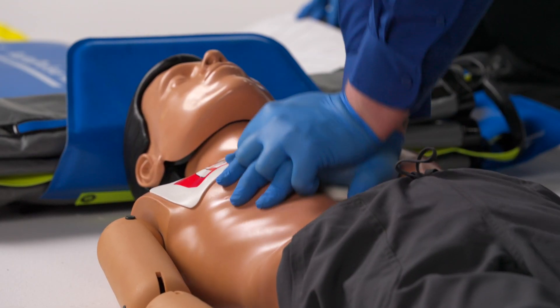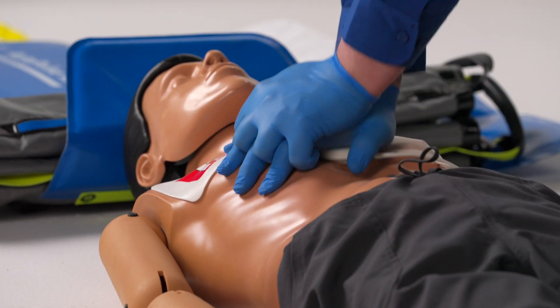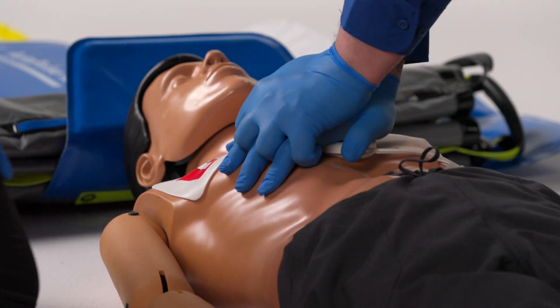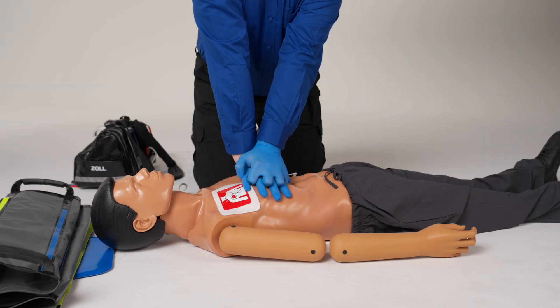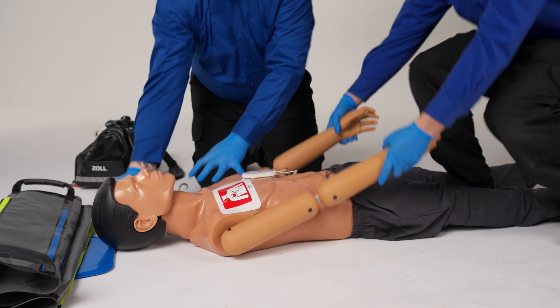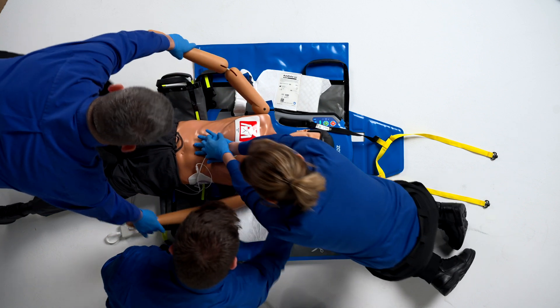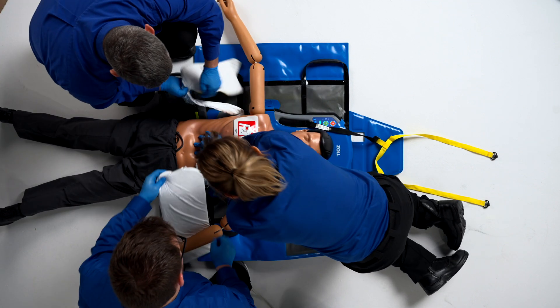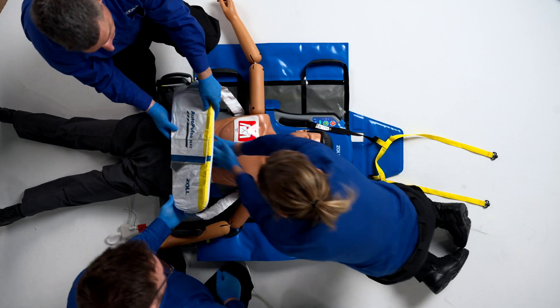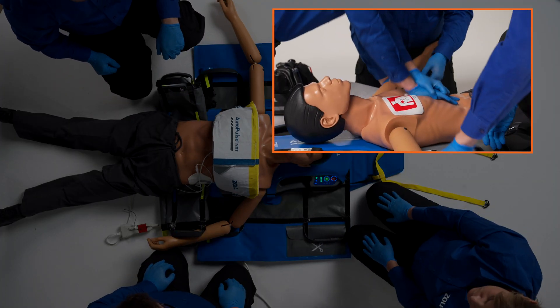With the AutoPulse NXT platform in position above the patient's head, sit the patient up in preparation for sliding the platform beneath them. A clinician can place a foot between the patient's legs and grab the patient's forearms, then pull the patient up toward them into a seated position. Once the patient is in a seated position, slide the AutoPulse NXT platform beneath them, aligning the yellow line on the board with the patient's armpits.